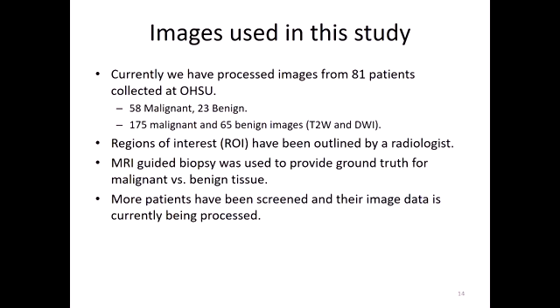And the MRI in-bore guided biopsy was used to provide the ground truth. So that's telling us that we verified that these are malignant or benign for our classification. The good news is more patients have been screened, and right now their image data is currently being processed. So we hope to get this data set larger in the near future.